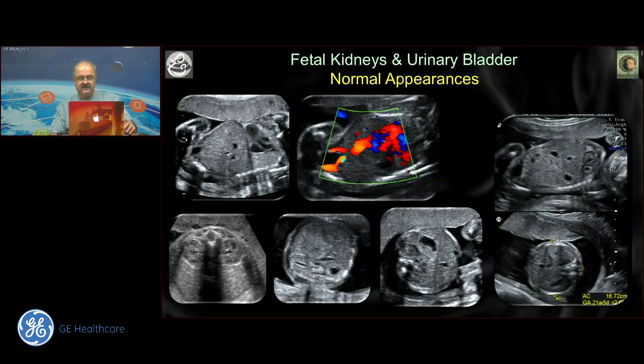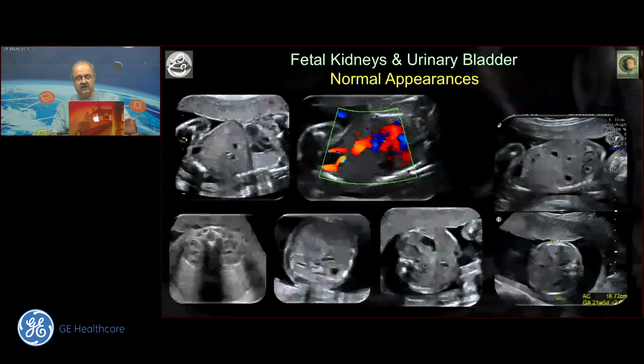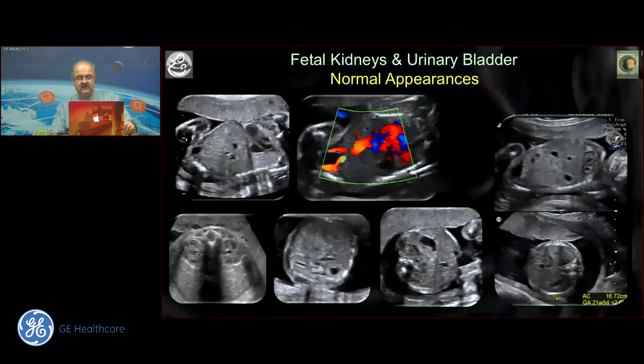B, the best section apart from the 12 o'clock spine would be a 6 o'clock spine. And since our abdominal circumference is done usually with the spine either in a 3 o'clock or a 9 o'clock position, this is not the best section to look for kidneys. For the kidneys, you always need a special section. And of course, the story doesn't end in just looking at it in the axial section. You have to look at it in the longitudinal section as well.